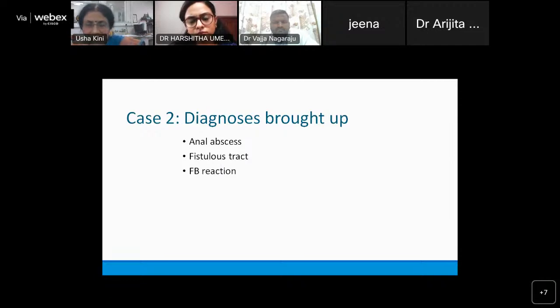Foreign body reaction. Did you find any foreign body? Yes, ma'am. I thought that was vegetable matter, ma'am. Where was it? One of the tissues showed that. Correct. But if you look, it was on the surface, right? It was not within the tissue, right? Yes, ma'am. So mind you, it is perianal, so it is exposed to all that fecal matter, and I'm sure a little bit of stuff might have been on the surface, and that must have got scooped out, I feel. But it was not inside a granuloma, to answer your foreign body granuloma. Agreed? Yes, ma'am.